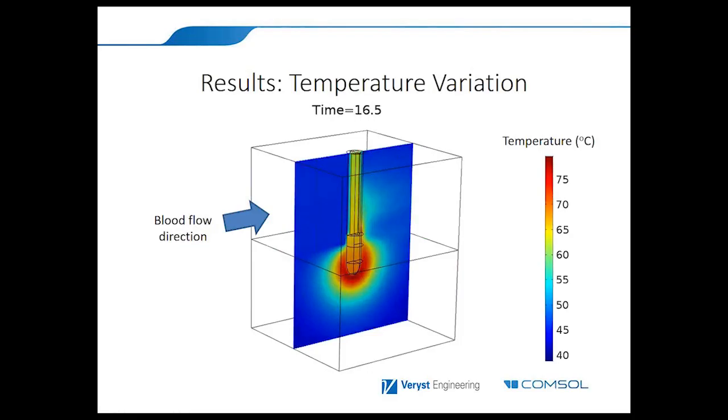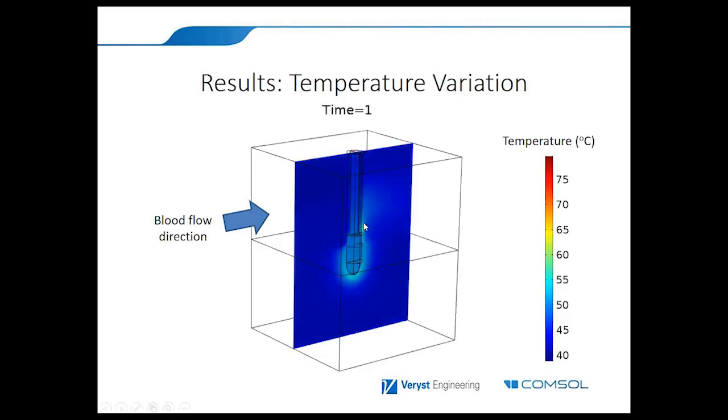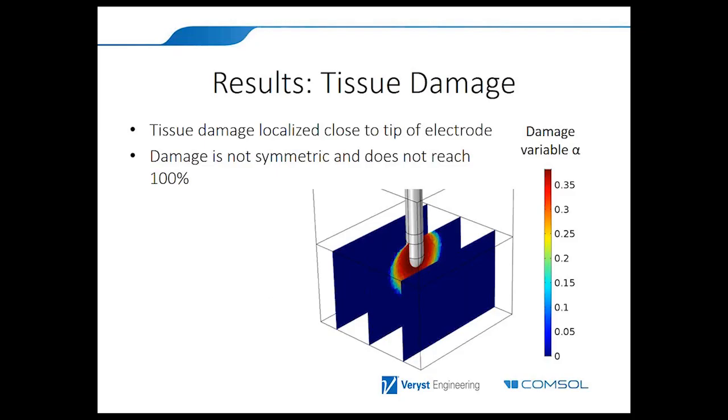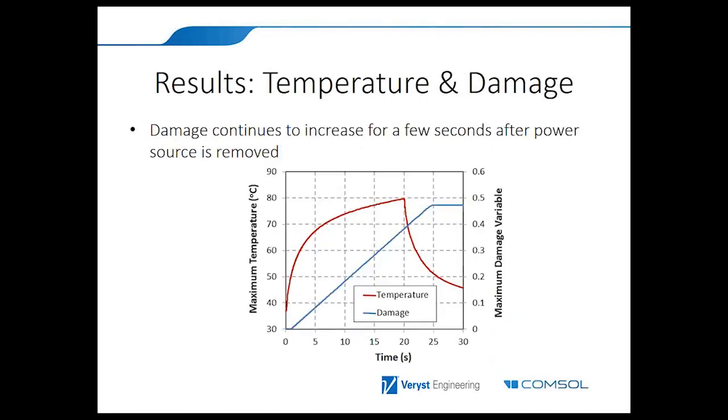You see it being non-symmetric. The downstream side heats up more because there's less efficient heat transfer through the fluid. I'll let that play one more time. We have the damage variable activated, so you can plot it here, and you see that damage is localized very close to the tip of the electrode. It's not symmetric, and it also does not reach 100% for the parameters that I selected here in the simulation. Damage also increases versus time. This is damage versus time, the blue curve, and the maximum temperature versus time is here.